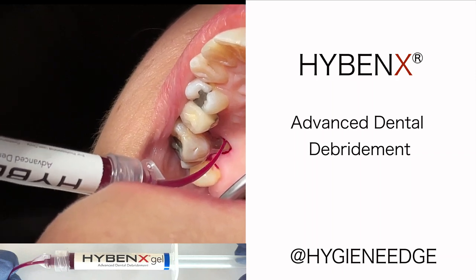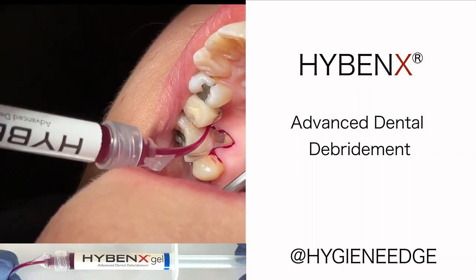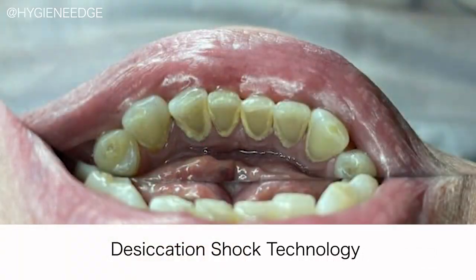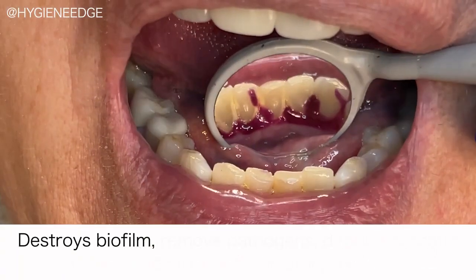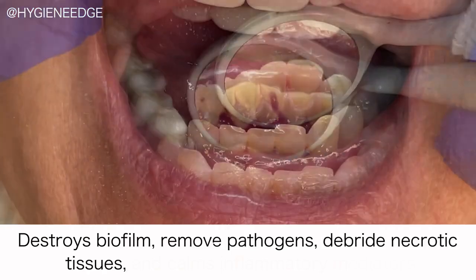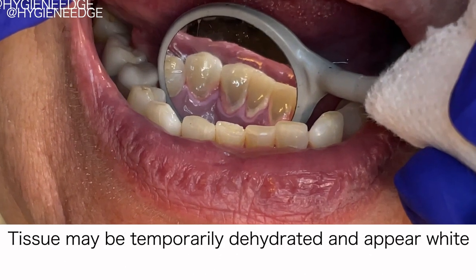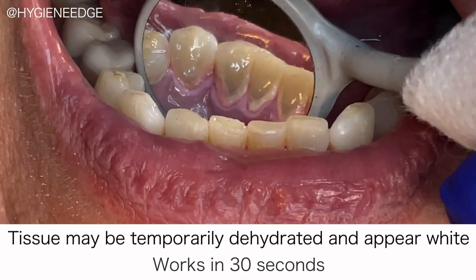This is Hybenex. It's an FDA-cleared, antibiotic-free cleaner that dehydrates the microbial environment by using a process called desiccation shock technology to destroy the biofilm, remove pathogens, debride necrotic tissues, and calm inflammatory mediators, all without harming healthy tissues. And it takes place in less than 30 seconds.